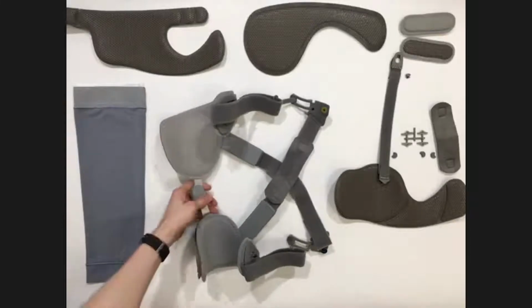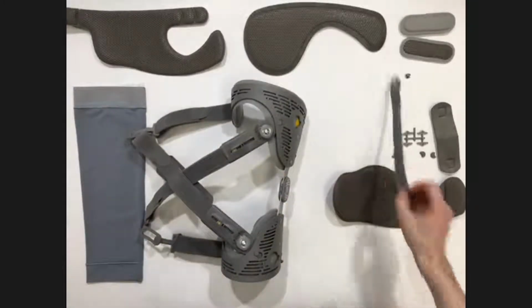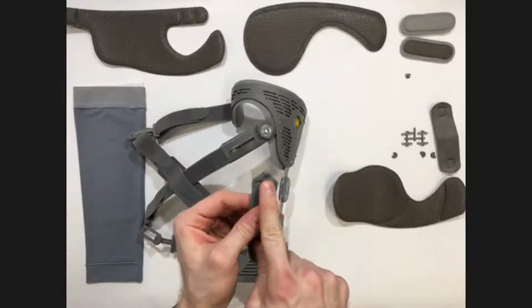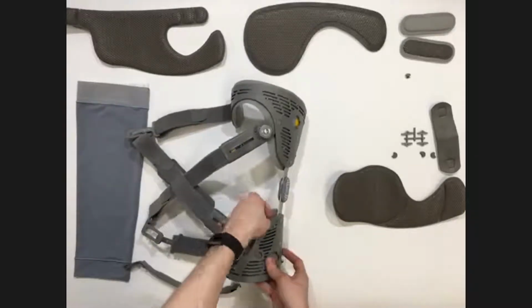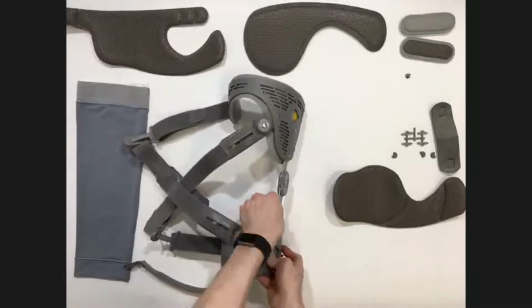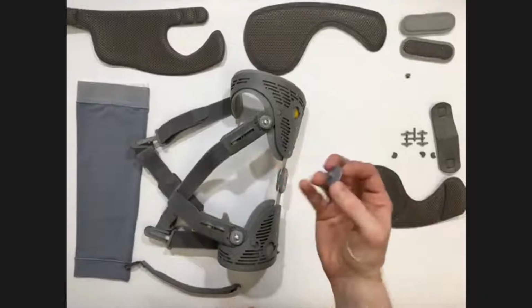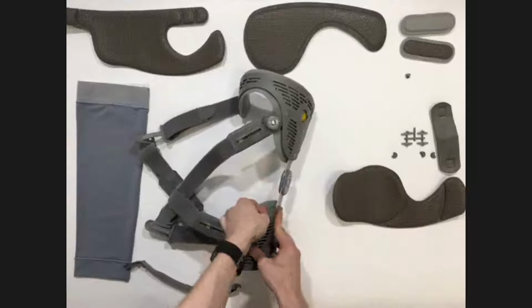Whenever we do this, we need to prepare an alternative method of suspension. So the gastroc strap actually has a connection here. Can you see that? And this utilizes the same twist fit technology that we use on the Velcro connections. So if I remove one of these Velcro connections from the frame, there we go. You can see with the Velcro connections, they don't have any adhesive on them. They mechanically attach into the frame like that either side.